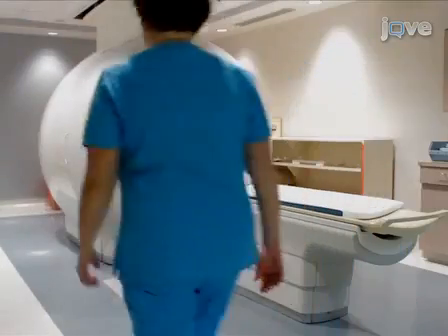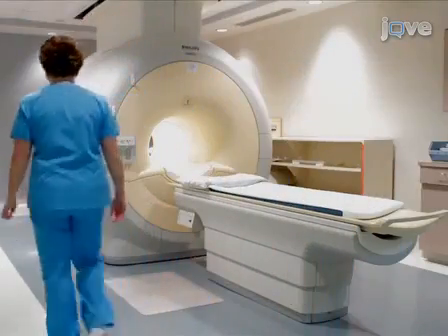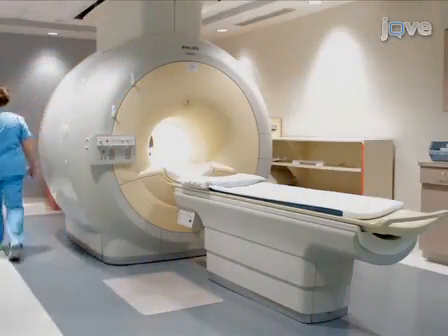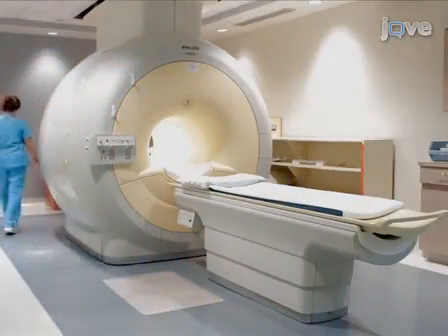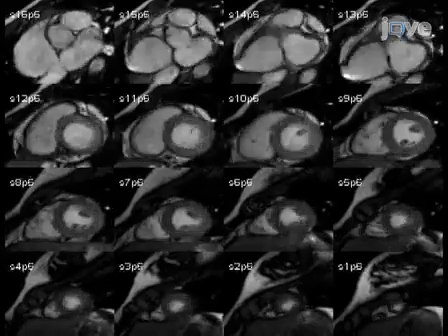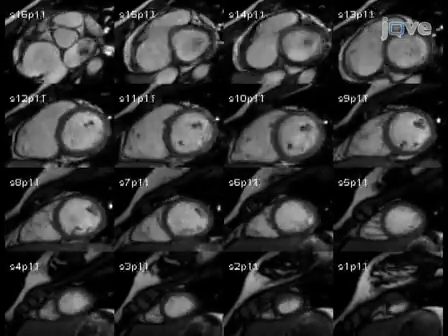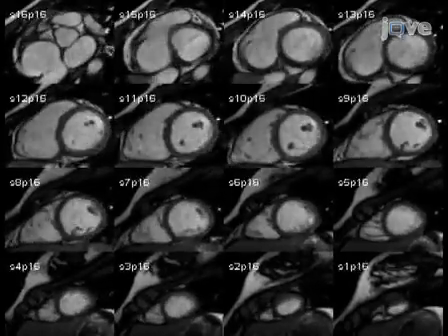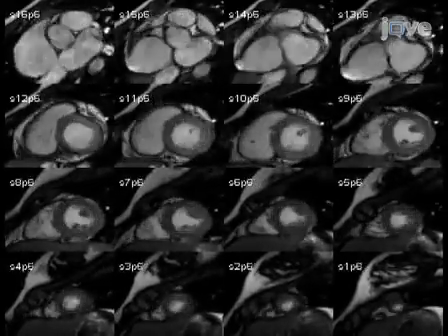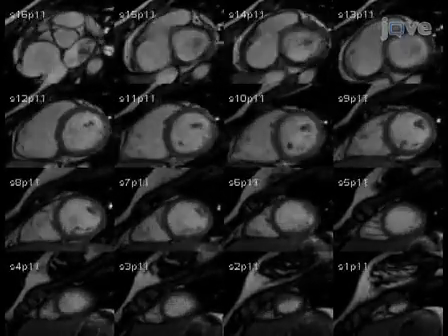The first step in the procedure is to acquire a standard cardiac MRI short axis sequence using a standard MRI machine with cardiac software. This is part of a standard protocol and no additional time-consuming tagging procedure is needed.